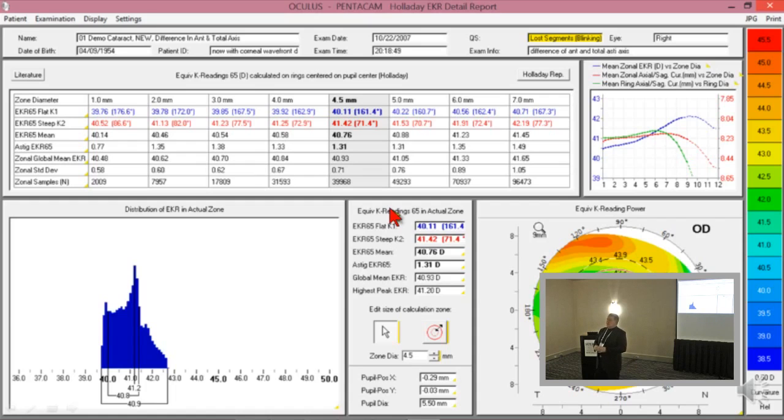The biggest mistake I ever see in a keratoconic eye, you know, the guy's got mild keratoconus, he doesn't need a transplant, you do cataract surgery. The keratometer takes the cap. So they end up with K readings that are 48 or 45, 48, 49. And the result is the guy ends up +4. And it's because he's not looking through the 49. He's looking through the 44 paracentral power, and that's the value that you have to use for the IOL calc.